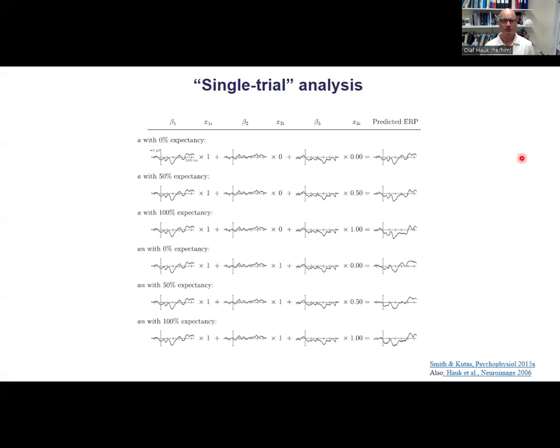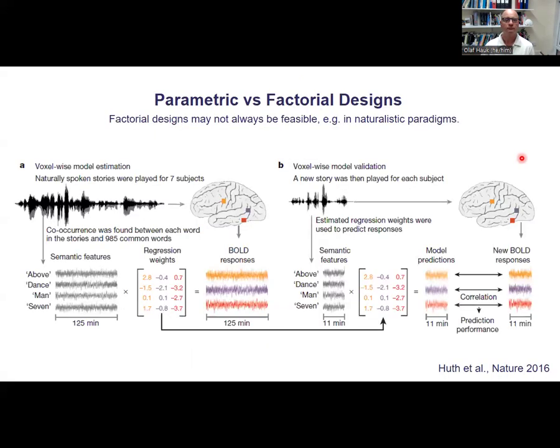What we've talked about before, about rejecting epochs and artifact correction, I think all this still applies. And this is usually the only way to actually get meaningful results from more complex experimental designs. For example, if you use more naturalistic experimental paradigms, let's say you're not studying words in a word-by-word paradigm where you present a single word every 2 or 3 seconds and you let your participants press a button if it's a word or a non-word or something like that.